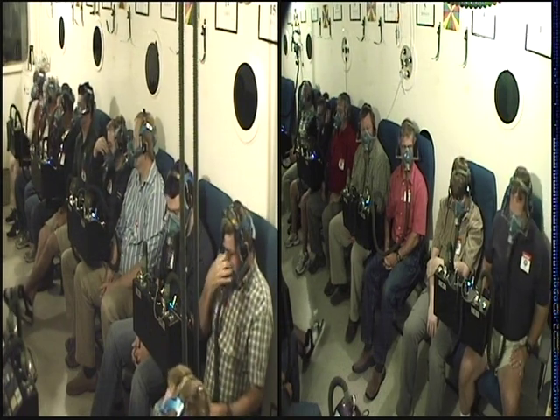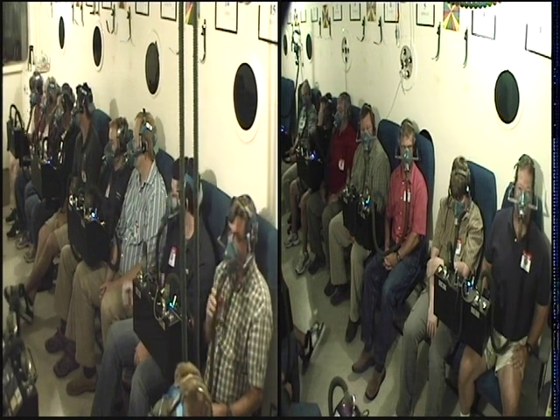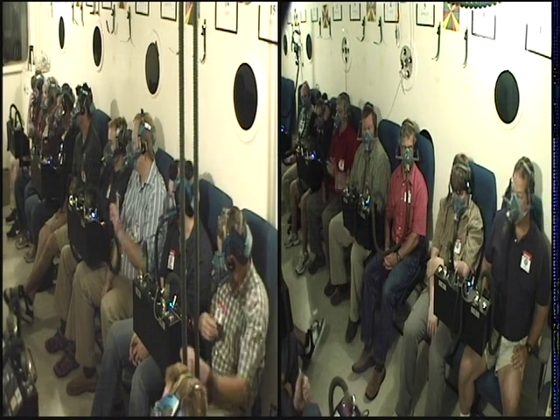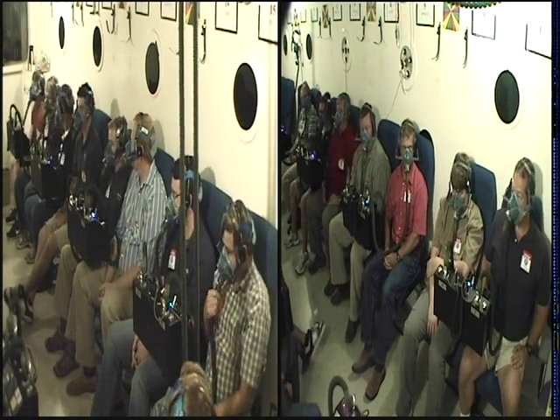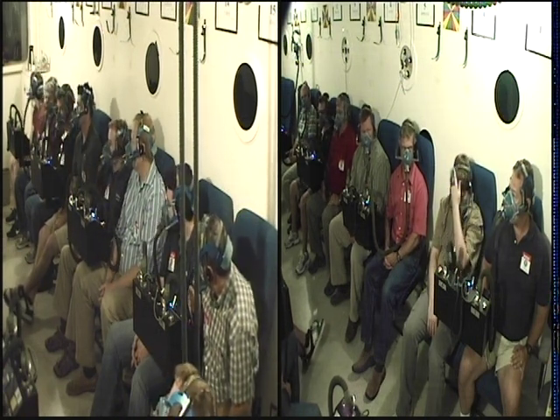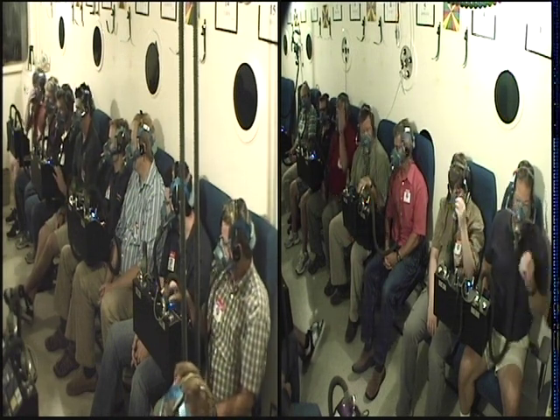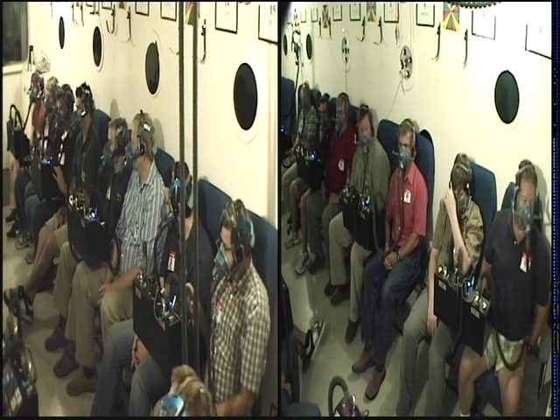Okay, with that, the demonstration we just finished, the night vision demo, how many of you noticed an improvement in vision when you went back on oxygen? Anybody? Very good. A bunch of you. Let's start right there in the middle. Is that Scott? Scott, what did you notice? You raised your hand pretty quick. Not with the colors, just with the symbology. Symbology was much more clear to you? Easier to make out? Good.